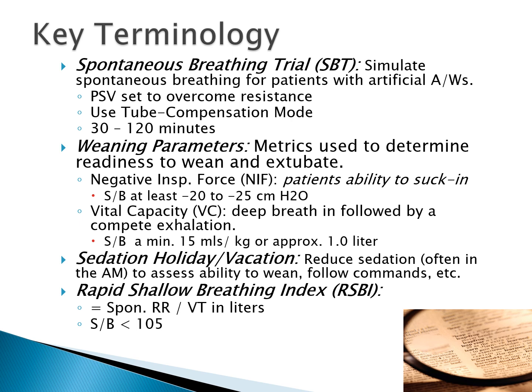So it really has to do with a diameter thing. And if you remember back to calculating the resistance imposed on a patient by an artificial airway, it has to do with the inside circumference or diameter of the artificial airway, and the length of the tube. Hence, and I'm getting a little bit ahead of myself, patients who have trach tubes, tracheostomy tubes, tend to wean better than those with endotracheal tubes, mainly owing to the issue of the length of the tube.